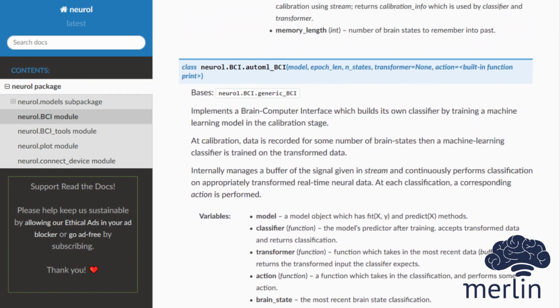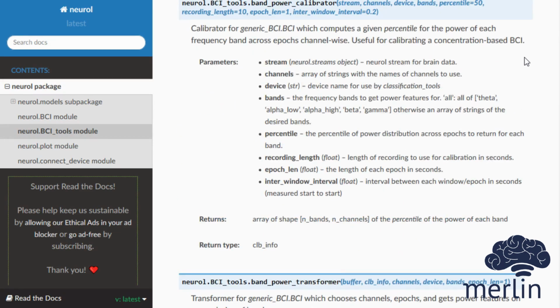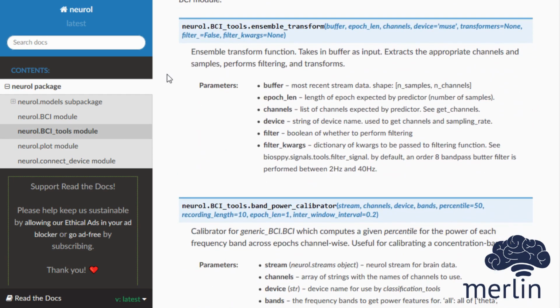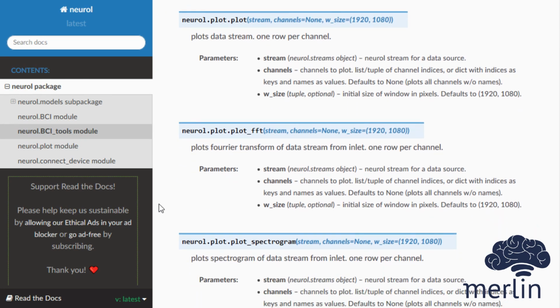To further fast-track BCI development, we also include a range of utility functions and visualization tools in Neurol to make defining the BCI's behavior as easy as possible. For example, there's a band power transformer, which returns the power of each EEG frequency band from theta to gamma. There is band power calibrator, which helps get a baseline of the power of each of these frequency bands. And then there's functions like ensemble transform, which makes it easy to define a sequence of different transforms and packages it all together. Finally, Neurol has some nice visualization functionality to plot real-time streams in the time domain or the frequency domain, or as a colorful spectrogram.